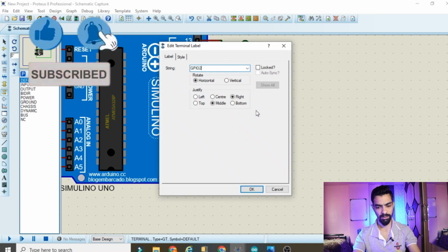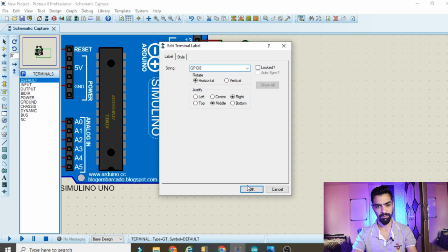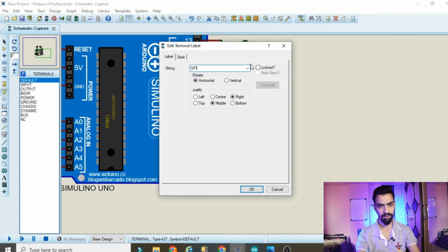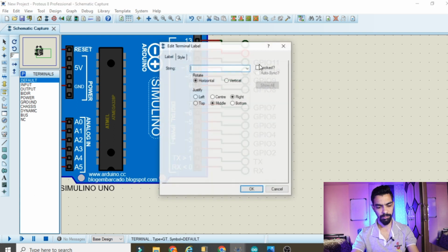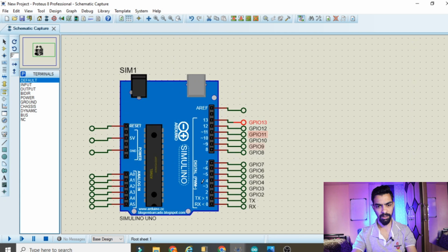then GPIO7, then GPIO8, then GPIO9, then GPIO10, then GPIO11, then GPIO12, then GPIO13. Okay, we have completed it like this here.